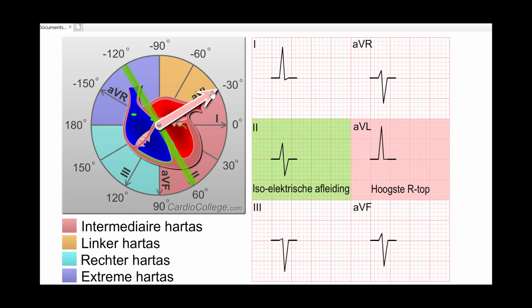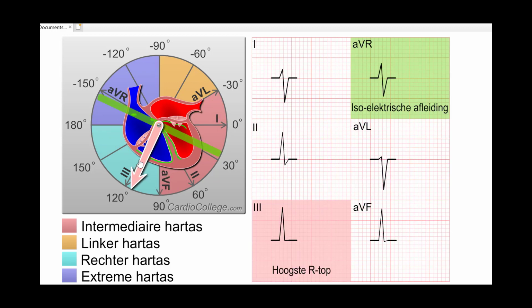So basically you can use these limb leads to figure out the axis of depolarization simply by analyzing which get the strong positive signal, which get a strong negative signal, and also if you can find an equiphasic lead. Now I've purposely stuck this one in between a couple of leads because that's more normal, and in this case we should see a strong signal in lead 3 and AVF, which we do.